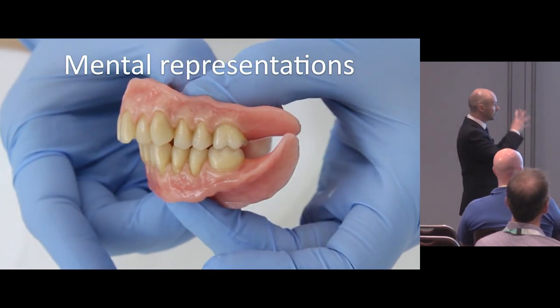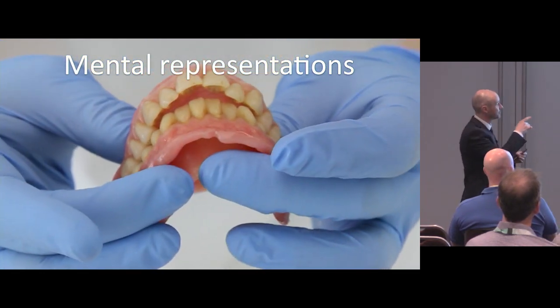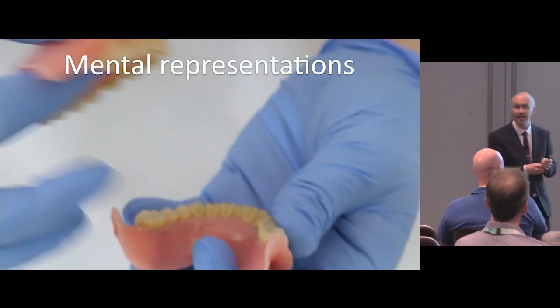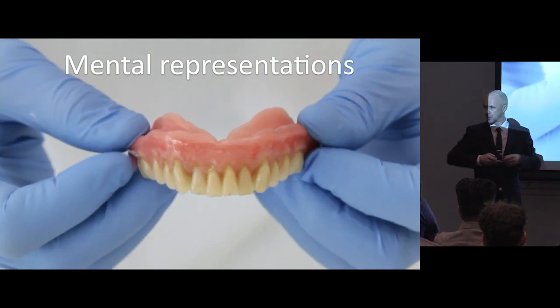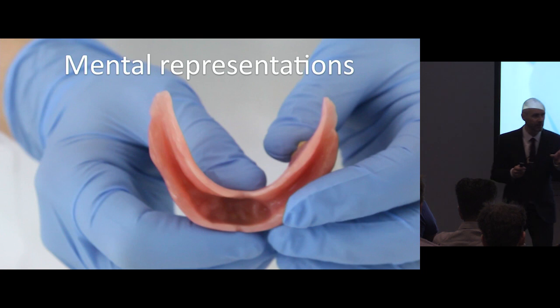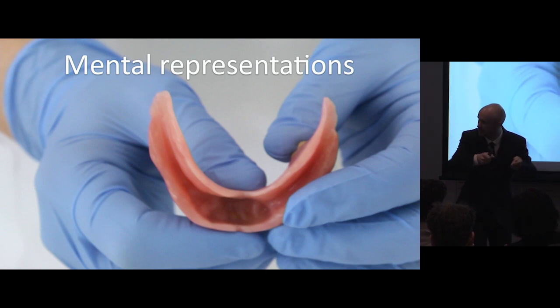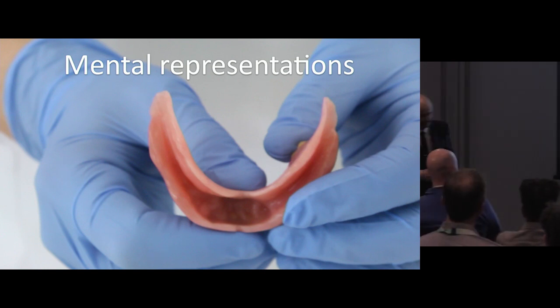So these are Bert's dentures that I just showed you, and I really want to have a really good idea of where I'm heading with them. I won't have an idea straight away of the look of the dentures, but certainly from try-in onwards. I'm talking about impression making and looking in the mouth and knowing what the shape of the impression should look like just by looking at the denture space that I've got. I really want to have a good mental picture.